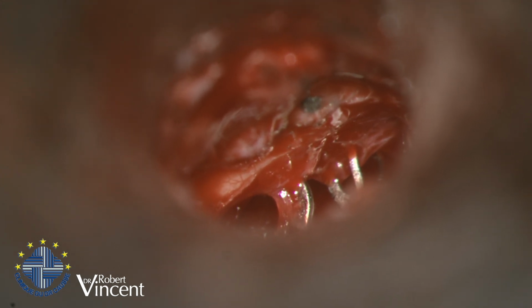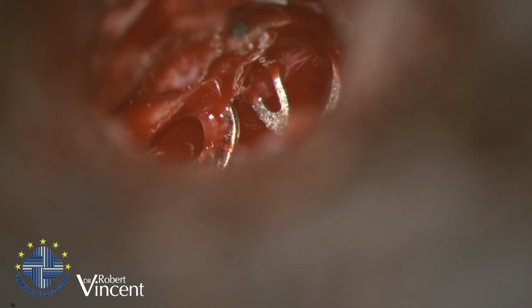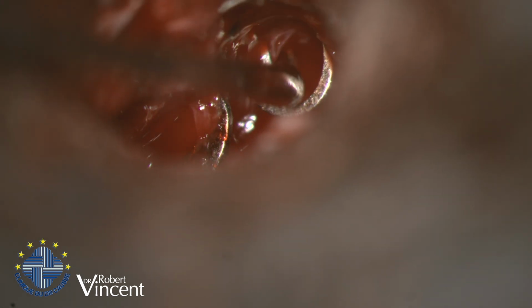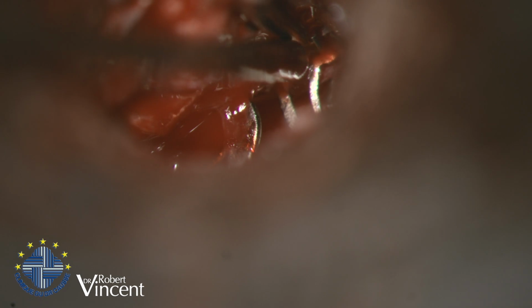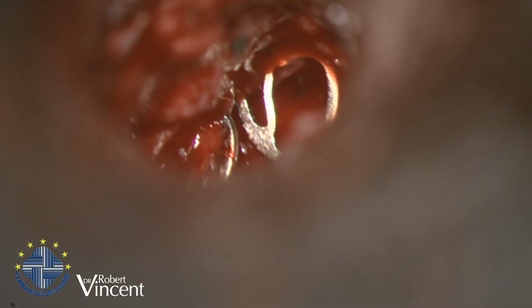Non, mais en plus, je pense que c'est la muqueuse qui est comme ça. Donnez-moi un 9, s'il vous plaît. I try to grab the prosthesis with a sucker. Well, there are two prostheses, I said, and both are not working. This very big one, and bent, can't work. This can't work for sure.